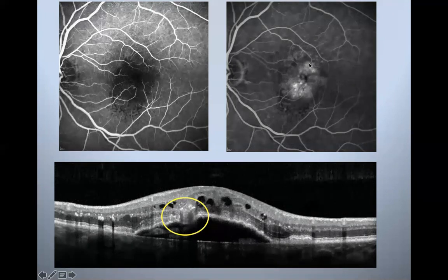On fluorescein angiography, it looks pretty normal in the beginning, and then it leaks in the end. You can see the cystic fluid of the intraretinal fluid leakage going on here. But now that we know that it's a RAP lesion, you can look back at this top left image and see these blood vessels going right down towards the fovea and sort of connecting. And that's where that neovascular complex is, where that RAP lesion sort of comes down through there.